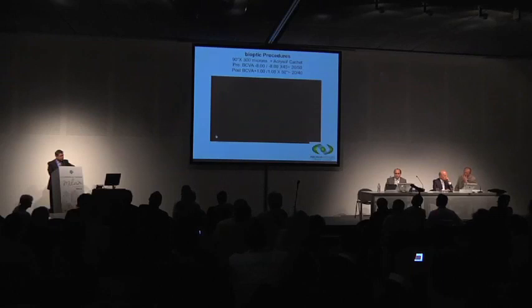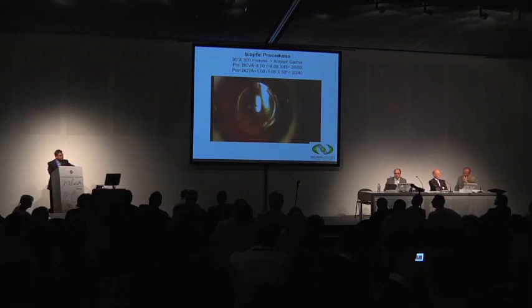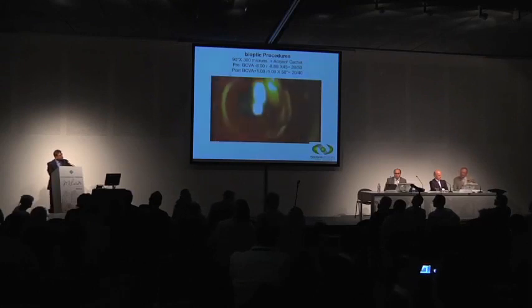This is an example of a patient that received 90 degree intracorneal segments, 300 microns thickness, and 6 months after, he received an Acrysof Cachet. Preoperative refraction was -8, axis 45, with 20/50 best-corrected visual acuity. Twelve months after the procedure, first the rings to correct the astigmatism, and 6 months later the Cachet IOL to correct the spherical component of the refraction, we achieved +1, -1, axis 50, for a best corrected visual acuity of 20/40.